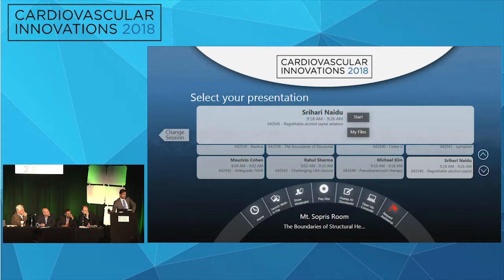They can't wait. You look at this patient here, there's no way this patient can tolerate an LVAD for 6 weeks. They certainly can. But if they were going to patch it and then put them on an LVAD, that just needs to decompress. The problem is that you're sewing in the mush and you have this huge pressure drift. What you have to do is remove the pressure differential somewhere. Right. And then you do that with Impella, which actually does a pretty good job of decompressing your ventricle, which is probably what I would have done. I think we would have done that now, right?